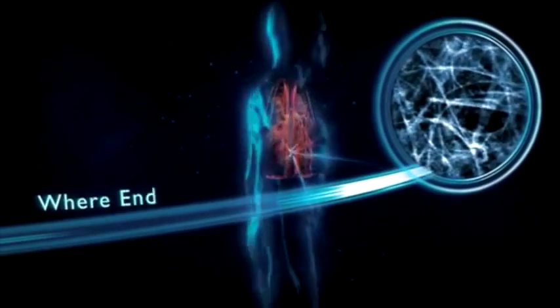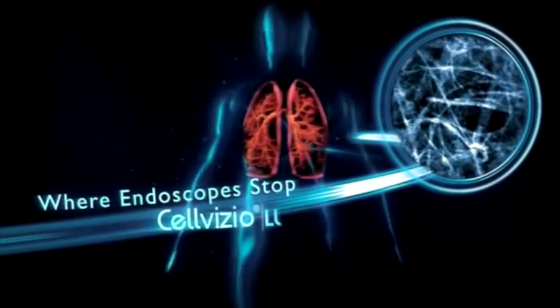Cellvizio Lung opens a new world in pulmonology with in vivo, in situ imaging of the entire bronchial-alveolar tract with microscopic resolution. Cellvizio by Mauna Kea Technologies. Where endoscopes stop, Cellvizio Lung begins.